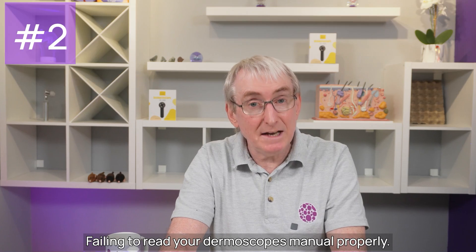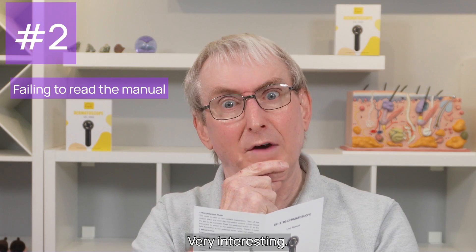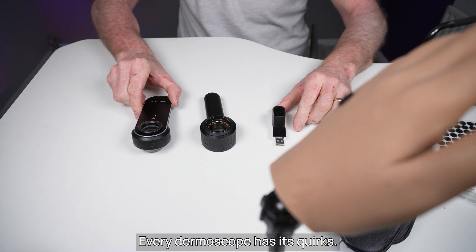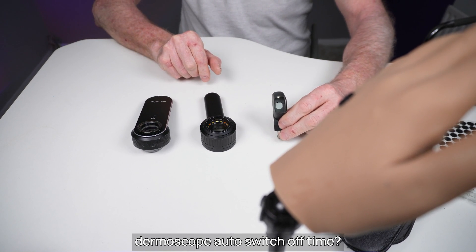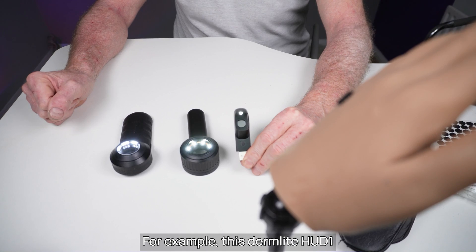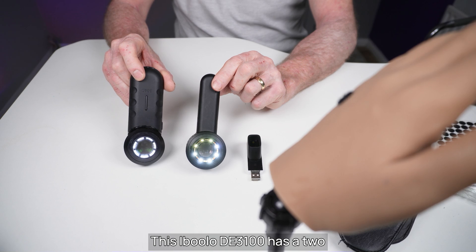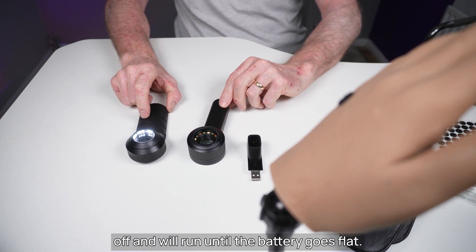Mistake number two: failing to read your dermoscope's manual properly. Every dermoscope has its quirks. For instance, do you know your dermoscope's auto switch-off time? Or you may just find your dermoscope going dark without warning. For example, this DermLight HUD-1 has a switch-off time of one minute. This Ibulu DE3100 has a two and a half minute switch-off time. Whereas this DermLight DL3 has no auto switch-off and will run until the battery goes flat.